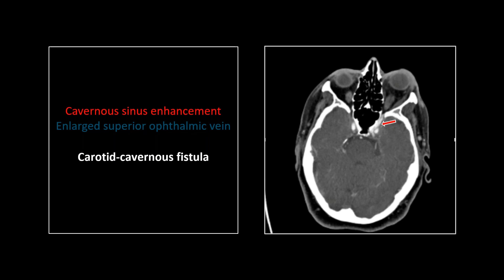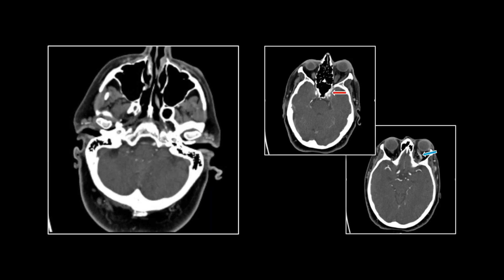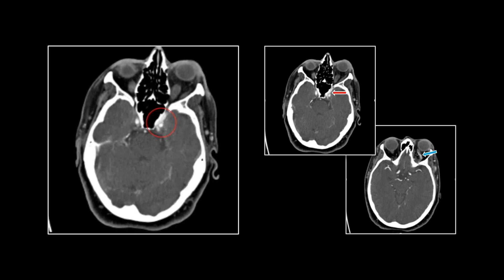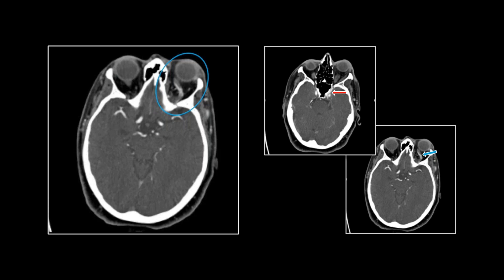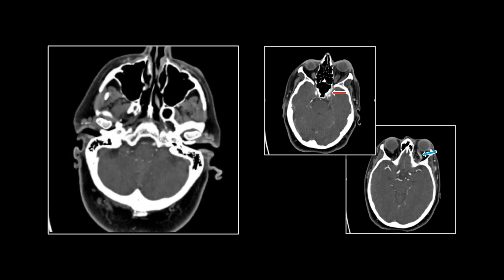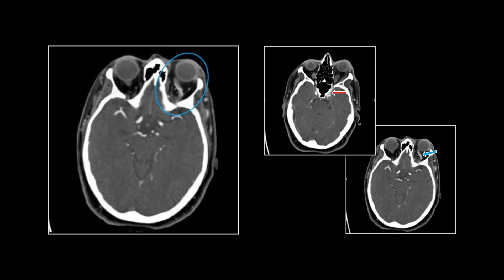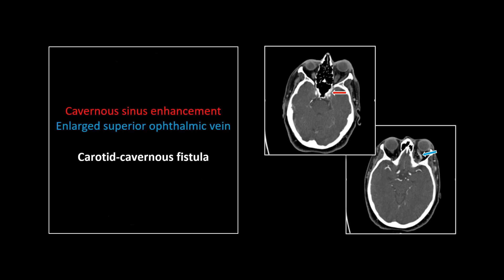This is quite a case. You can see there is contrast opacification in the left aspect of the cavernous sinus, which should not be there. And then the classic finding: our superior ophthalmic vein is markedly enlarged and showing retrograde contrast opacification. Those veins are valveless, and that's why it will manifest this way with chemosis and exophthalmos. So there is that dilated and enhancing superior ophthalmic vein and the enhancing cavernous sinus. That is a carotid cavernous sinus fistula.